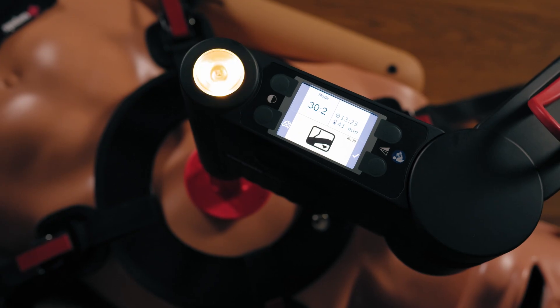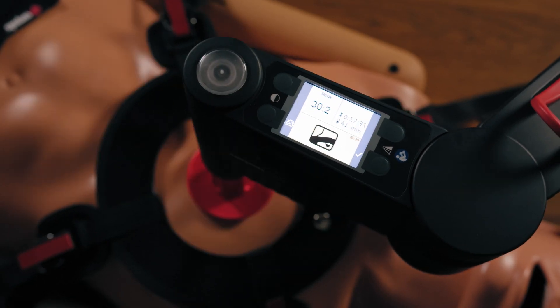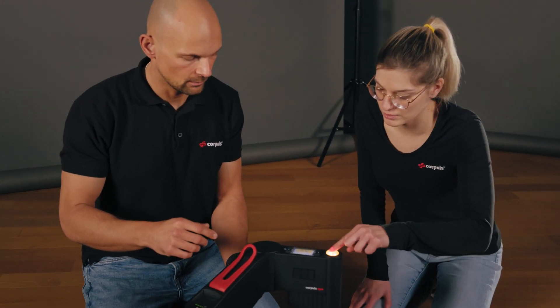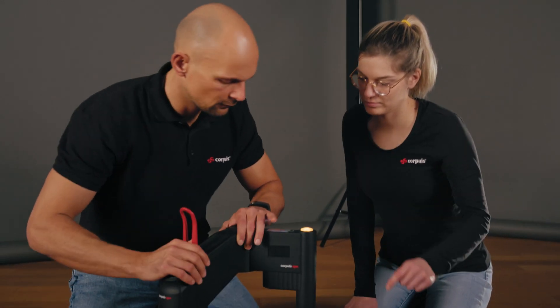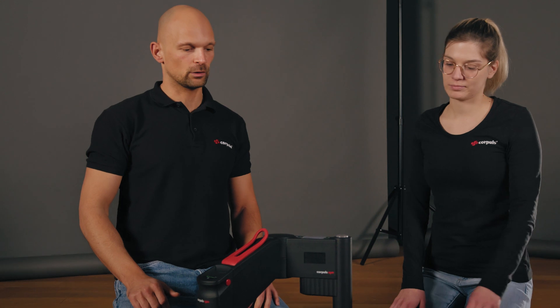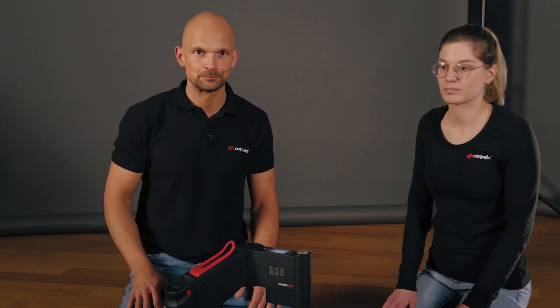Now we have the yellow 'compensation range has been exceeded' alarm. To respond, stop the therapy, open and adjust the arm manually, then close it. Once confirmed green, therapy carries on again. This adjustment can also be integrated smoothly into a ventilation break.